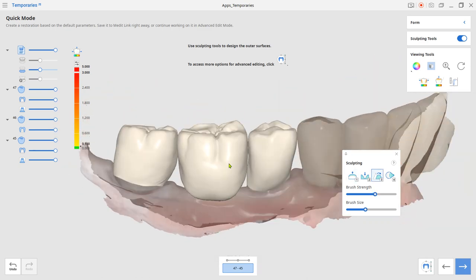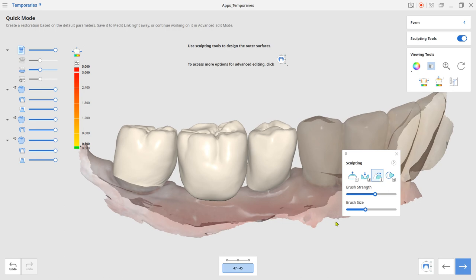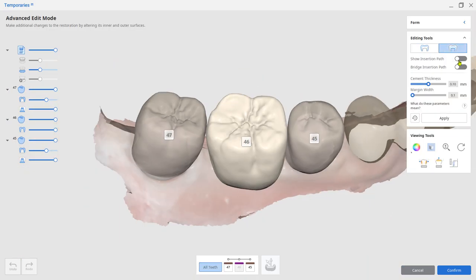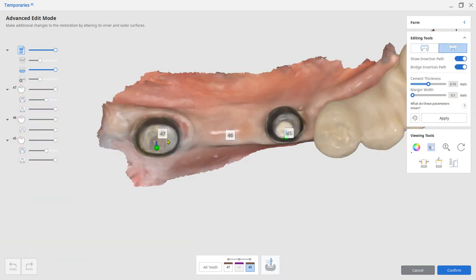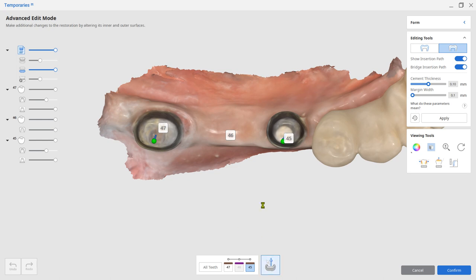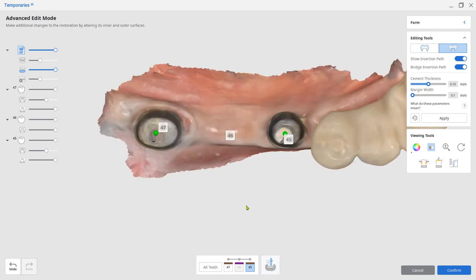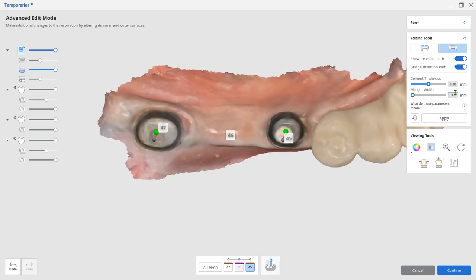And go to Advanced Edit Mode from the bottom for more detailed adjustments, such as insertion path, cement thickness, and margin width.